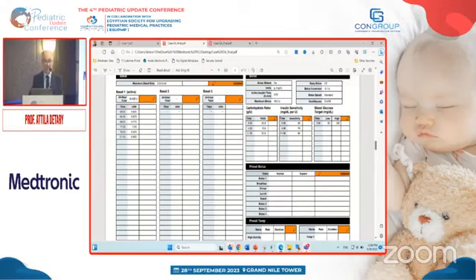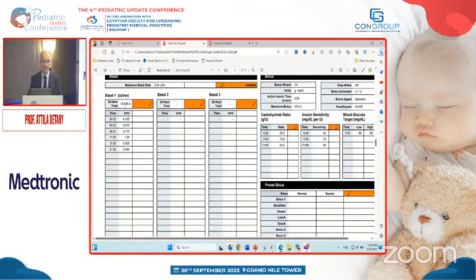The settings, have a look at the settings. So, I was trying to guide you how to do the settings. So this is a little bit sophisticated. In my opinion, could be a little bit simpler, but the principle is roughly the same as I explained at the beginning. So during the night until 4 o'clock, it's 0.425. So we have a total 18 per day. It's in the top, you see, 18.4 to 5, that's the total for 24 hours. And it is distributed in this way.